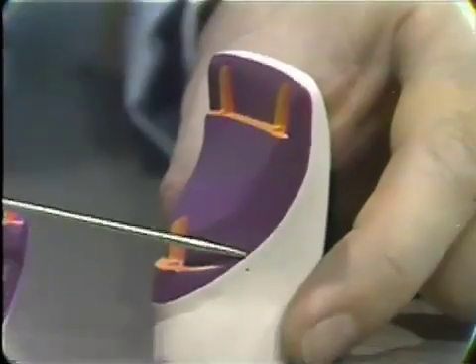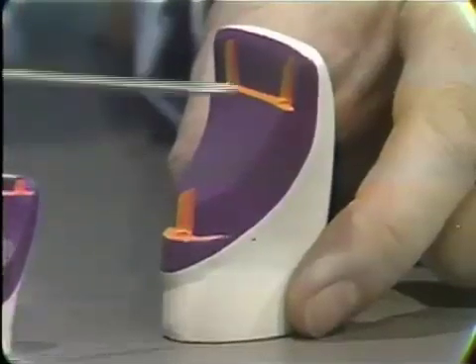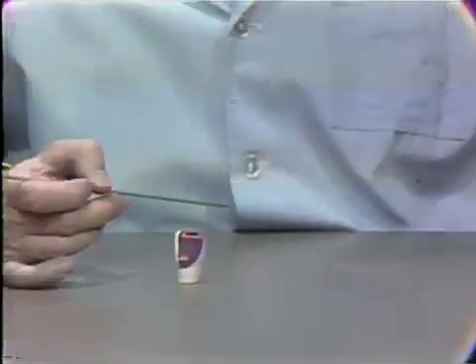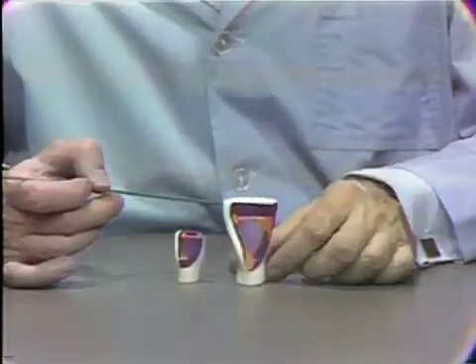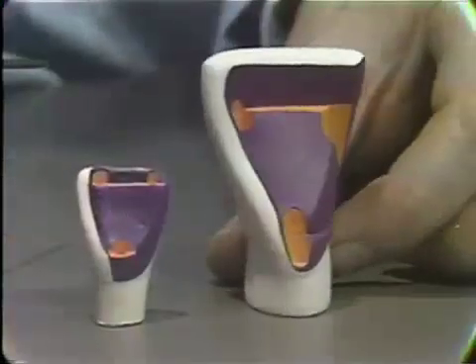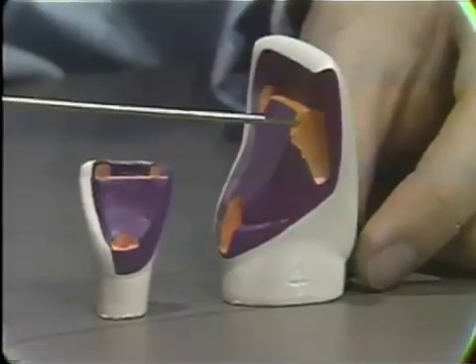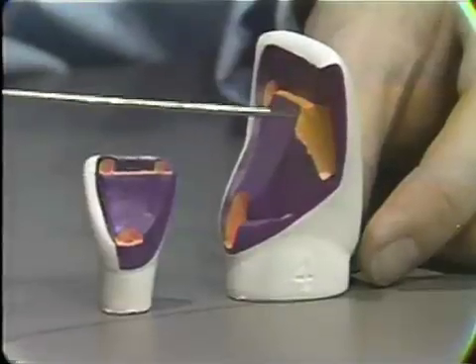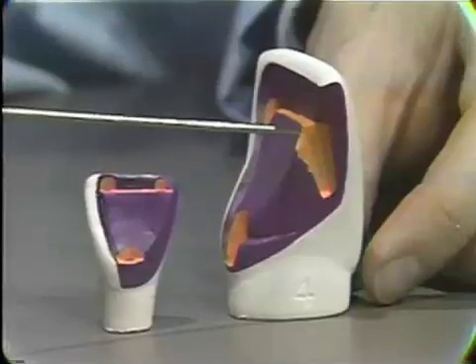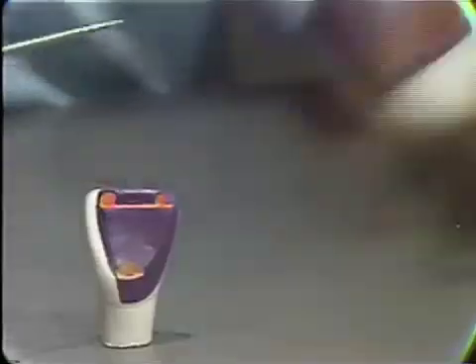You can see again here how the proximal extent is something that can be varied without in any way influencing the retention, which is all on the lingual surface in this situation. Modifications can be made to the pin ledge preparation in very similar manner to those for the three-quarter crown, and in cases where perhaps previous restoration has resulted in the loss of tissue here, where normally a pin would be placed, a groove or a box can be cut of varying size according to the particular situation, and retention is gained then by one groove and two pins in this situation.